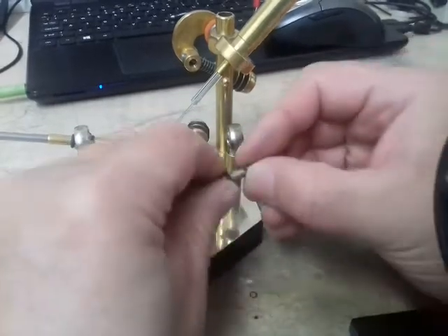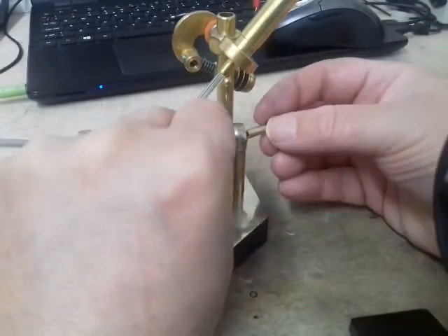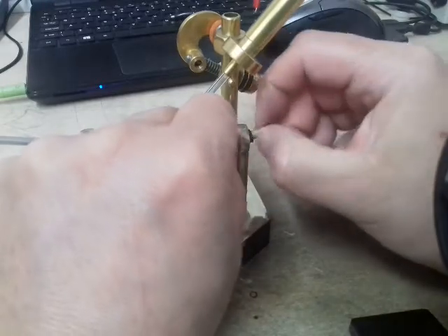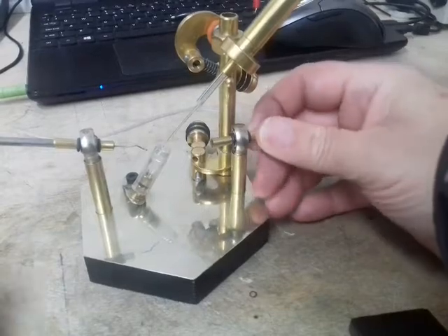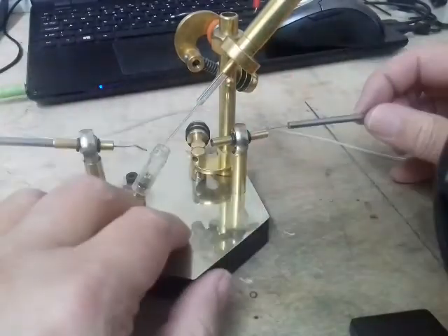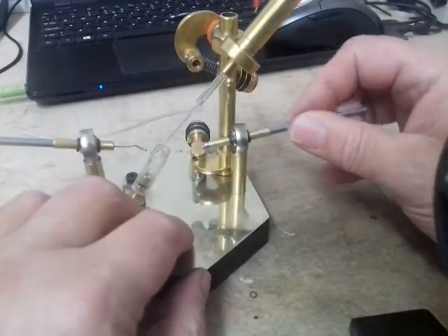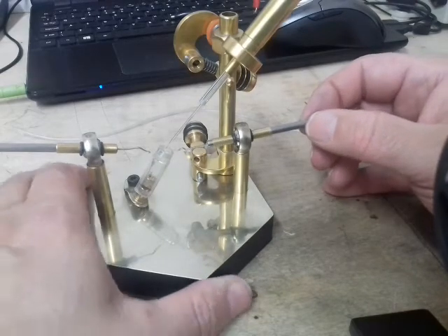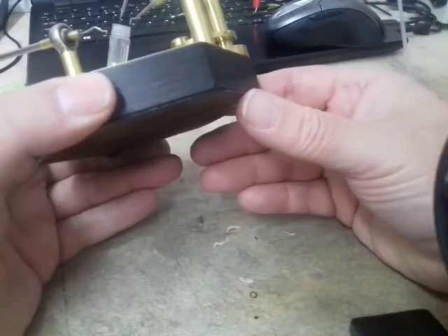It's a usable, viable device. Cheap and cheerful, but works very well. I don't think there's anything else to add.